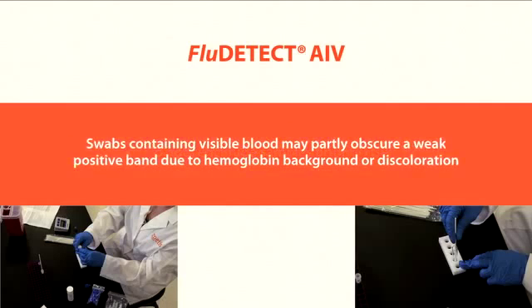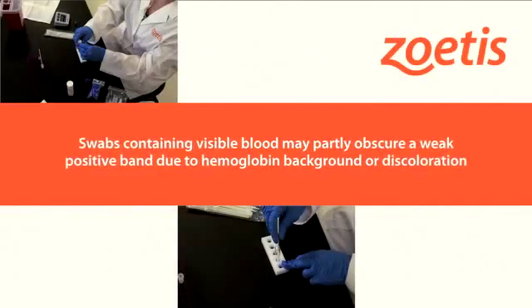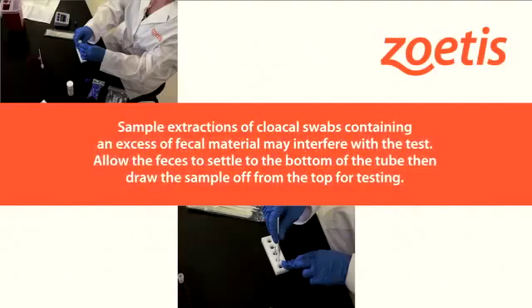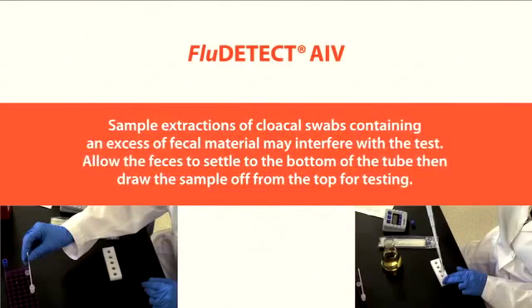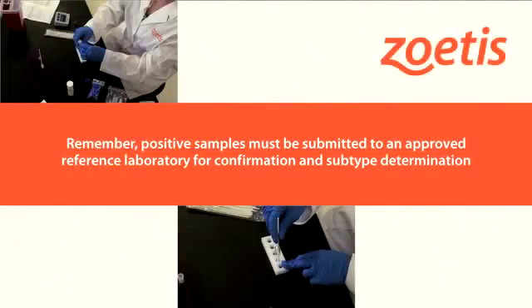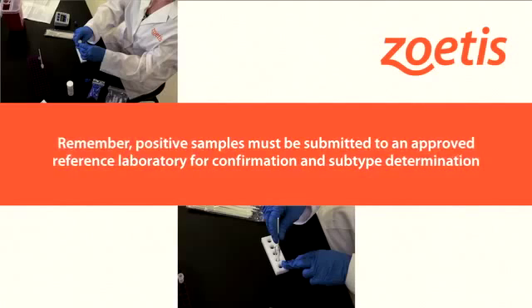Swabs containing visible blood may partly obscure a weak positive band due to hemoglobin background or discoloration. Sample extractions of cloacal swabs containing an excess of fecal material may interfere with the test. Allow the feces to settle to the bottom of the tube, then draw the sample off from the top for testing. Remember, positive samples must be submitted to an approved reference laboratory for confirmation and subtype determination.